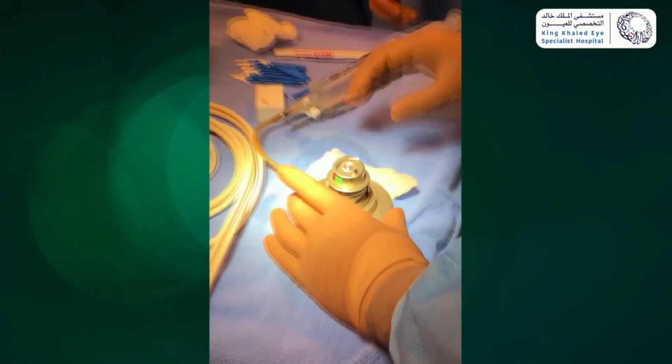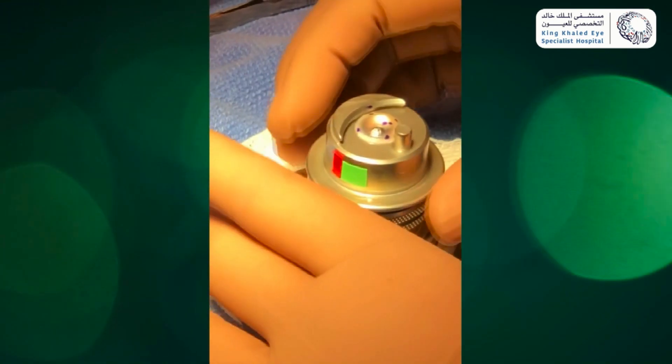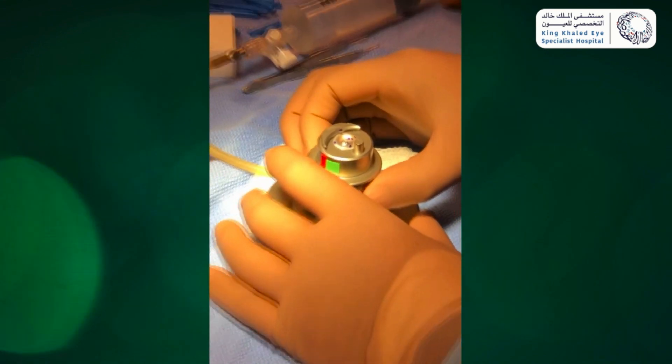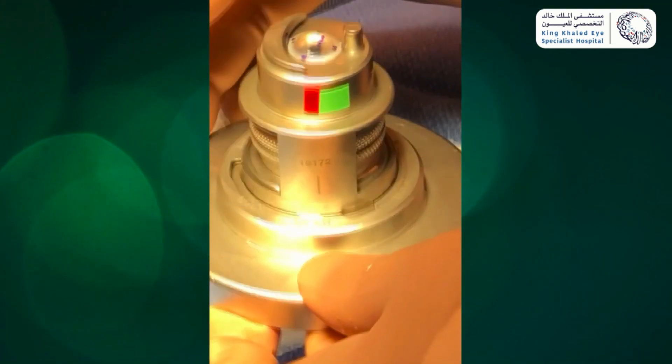Then release the chamber pressure and lower the piston slowly to prevent the cornea from deforming and unlock the base. Flip it and gently grasp the cornea using the forceps from the scleral rim and gently place the cornea on the trephine.